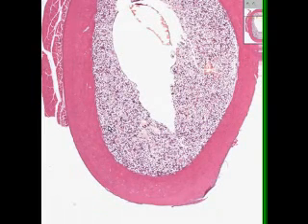Here we are back to our section of rib. In this rib, you can see very dense pinkish material, which you will see as classical for cortical or dense bone, while the inside of the rib contains fat and cells, the fat being normally found in our marrow and the cells being hematopoietic cells, giving rise to red cells, white cells, and platelets, found in the bone marrow of the bones of the central or axial rather than the appendicular skeleton.